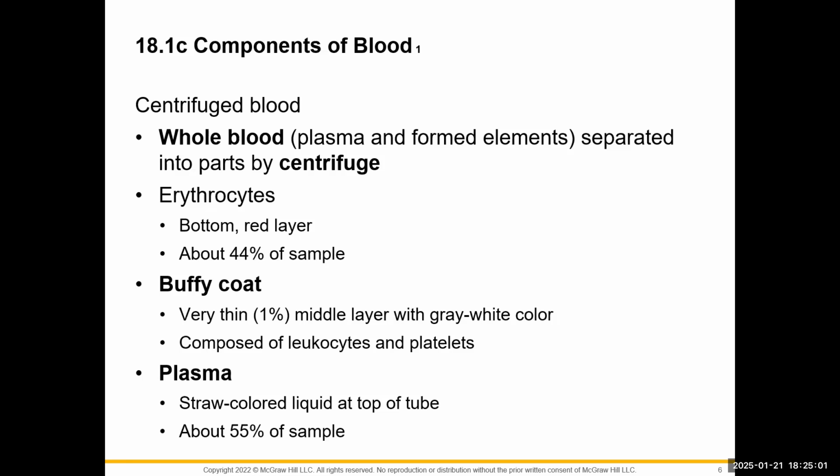And so they'll stick it in the centrifuge and it will spin around, I want to say roughly for about 10 minutes or so. And it's going to start to separate out parts of your blood, namely your formed elements and the blood plasma. So here's what we're going to see.